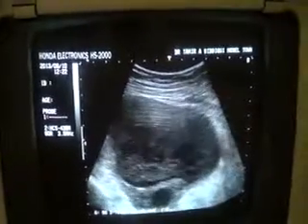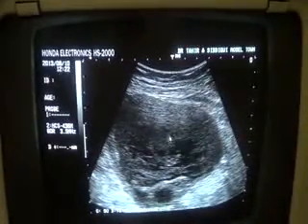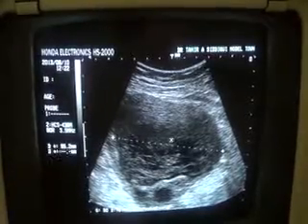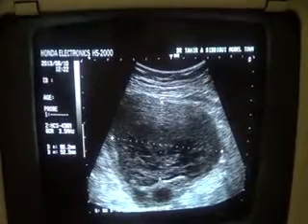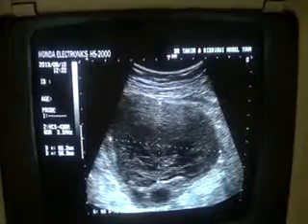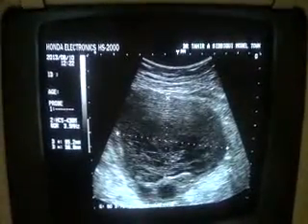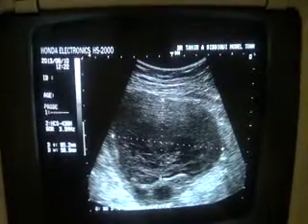You can see layered out material within the cystic area. This is the cyst, right adnexal cyst, measuring almost 9.5 into 5.6 centimeters, but when surgical intervention is done, it will be more than 10 into 6 centimeters.